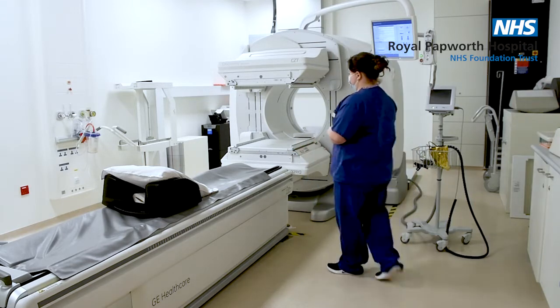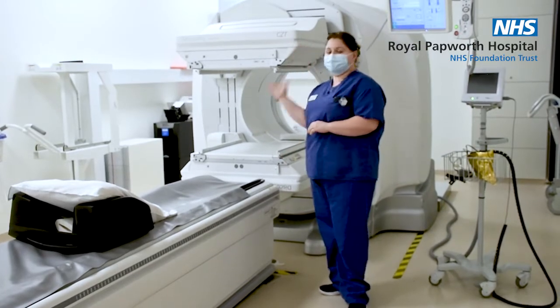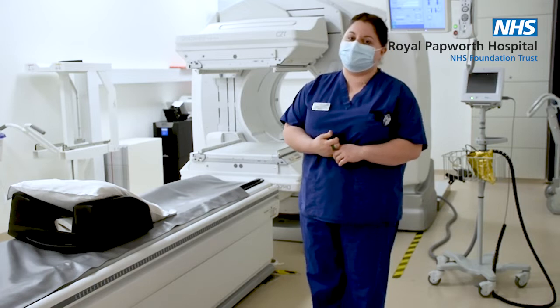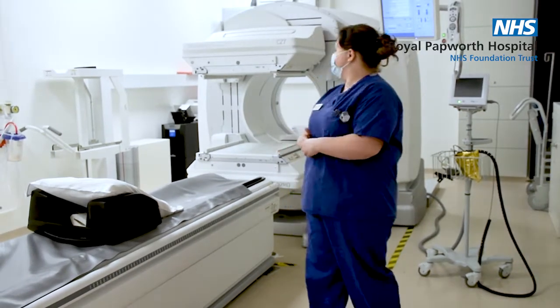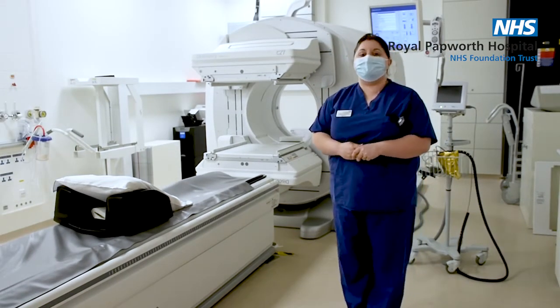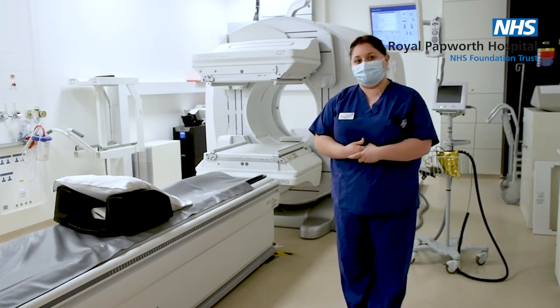As you can see here, we have the gamma camera part which is these two scanners at the front. This will pick up the radiation that we give to the patient an hour prior to their scan, so it's collecting information coming off them. At the back, the bit that looks like the giant donut is our CT scanner, and that gives us anatomical information and helps enhance the SPECT image of the heart.